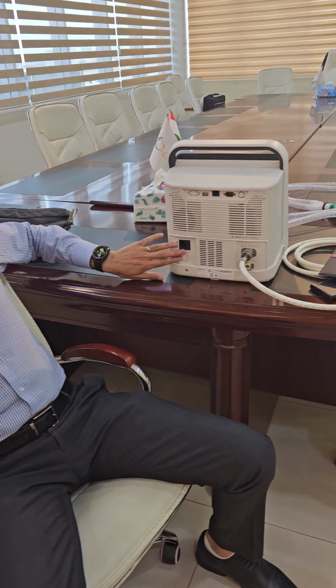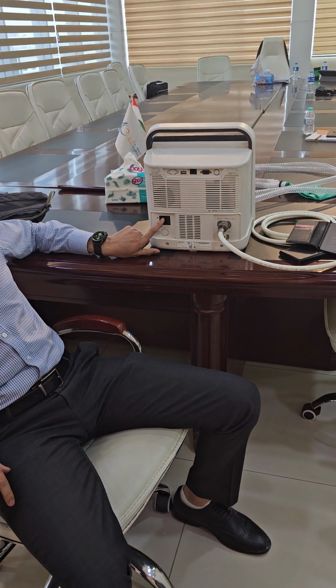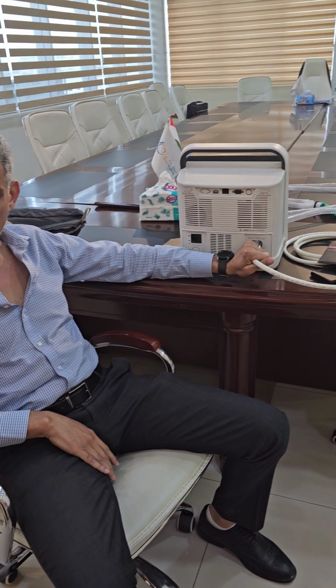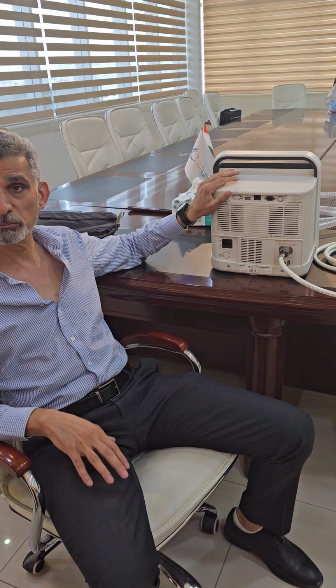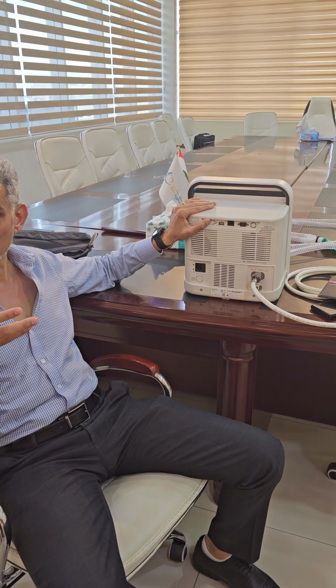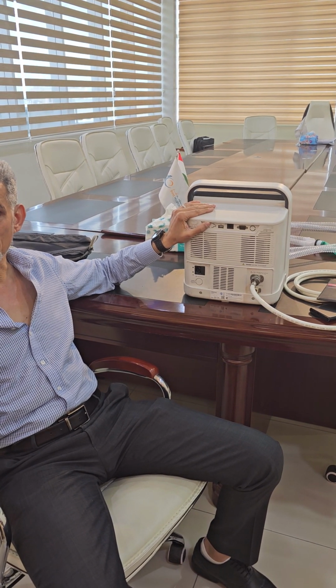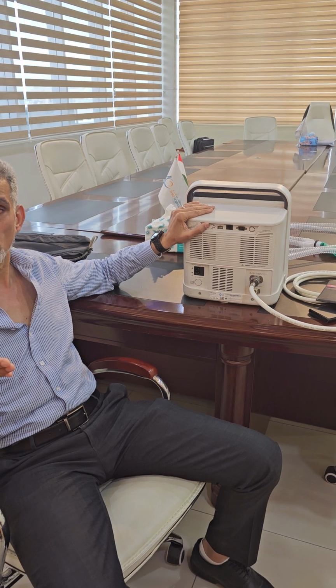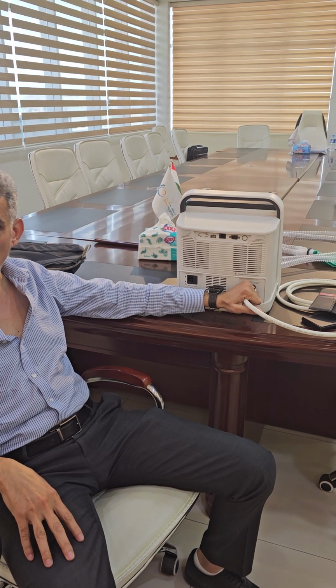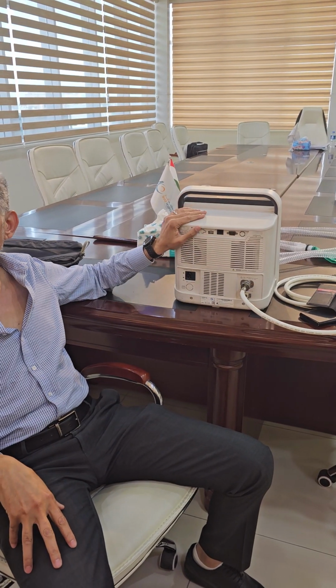Okay, this power supply here is from the power supply. This white port is only for oxygen because it's portable. It has a compressor inside it. So the ventilators are two types, with compressor and without compressor. A compressor is like a fridge. It generates pressure and gives us air so the ventilator can work, because all the ventilator valves work by pressure. Without pressure the ventilator will not work. This only gives oxygen connected to the bottle, to the wall, whatever, but the ventilator always needs pressure.